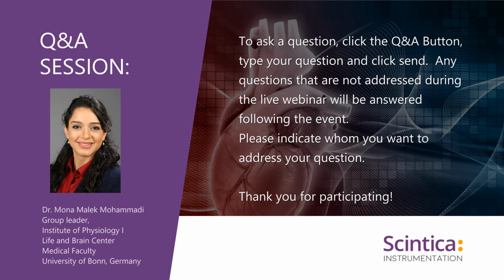No, absolutely not. But that's why I mentioned that you need to clearly see the aortic arch. And when you see it, you will clearly see that there is a distance between the heart and the aorta. When you are inserting the needle out, you need to go between this space. It is little, but you will see it. It is white, and you need to come out in this space. Otherwise, you will damage the heart.